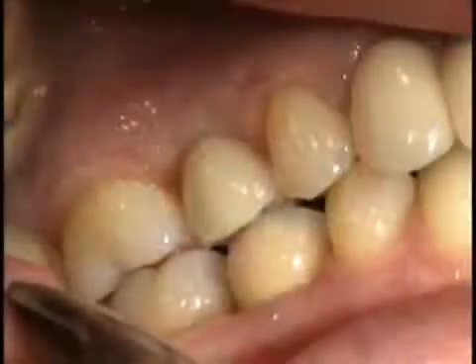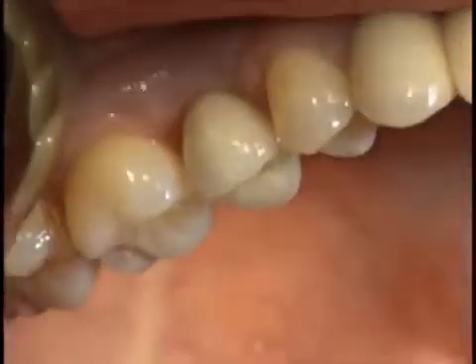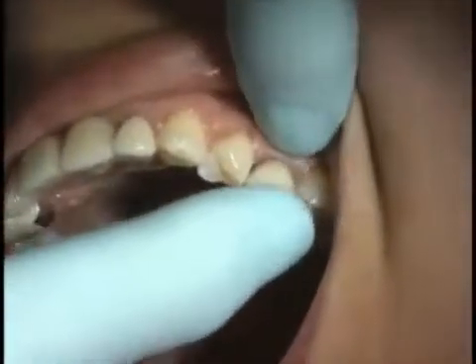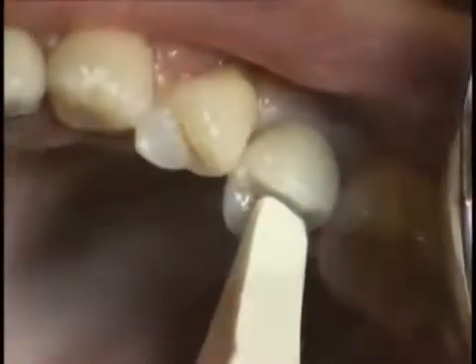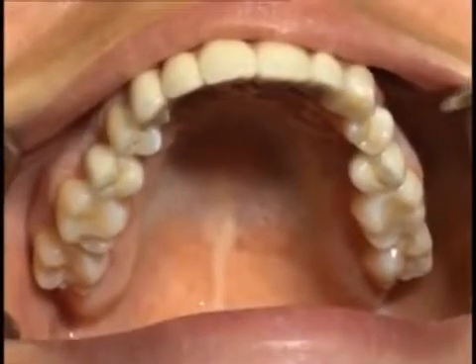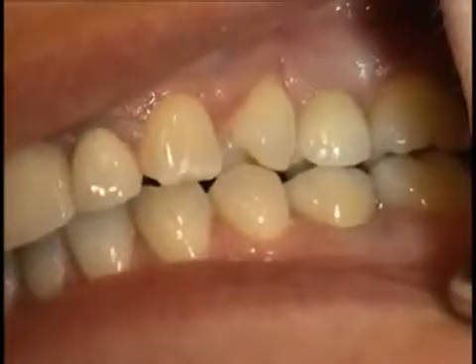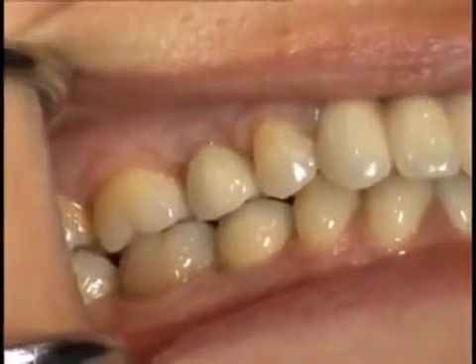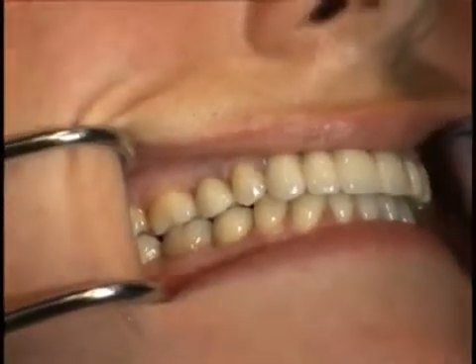Now the restoration is ready for trial insertion in order to check for proper occlusion and articulation. If necessary, any occlusal corrections are made, followed by final polishing. A glass ionomer cement or zinc phosphate cement is used for final cementing. The synoctor cemented abutment for cement-retained restorations allows custom shortening by approximately 1 to a maximum of 2 mm, which can be done directly on the model, and the safe transfer of the abutment from the model to the implant.